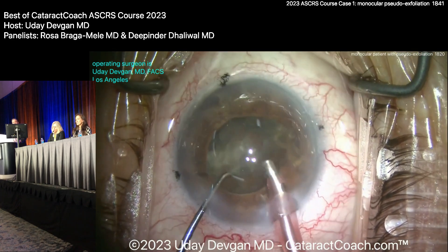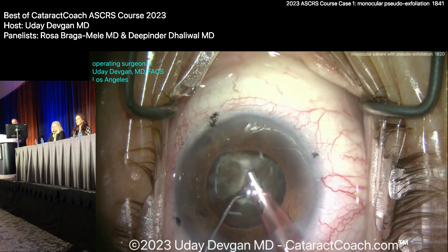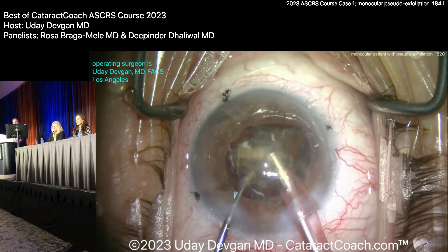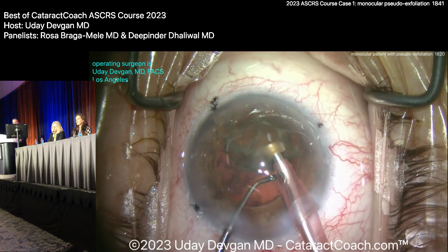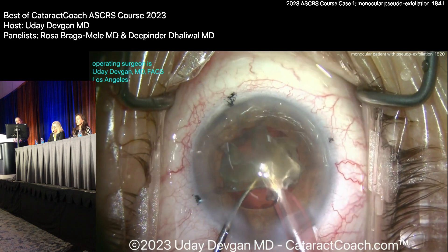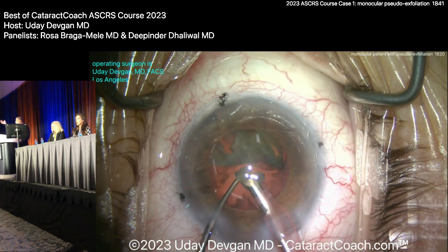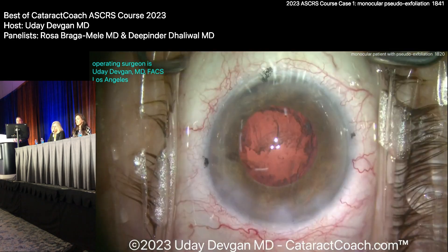Luckily for an 88-year-old, the cataract is actually not that dense. We'll get the pieces up and do further chopping — video shown at high speed. This looks pretty reasonable and I'm pretty happy. As the last piece comes up, I'm really wary of having that floppy bag come up and hit the phaco tip — don't ask how I know — so I'll keep the chopper on that safe position and protect things. Come on up and you could also replenish with viscoelastic.